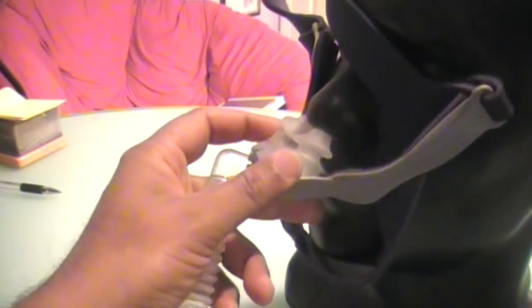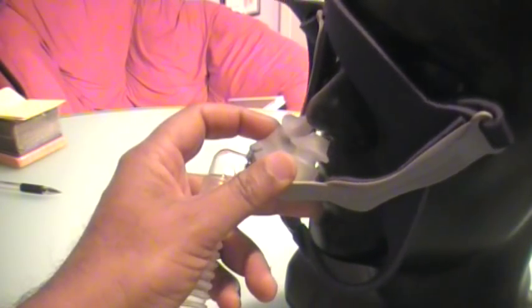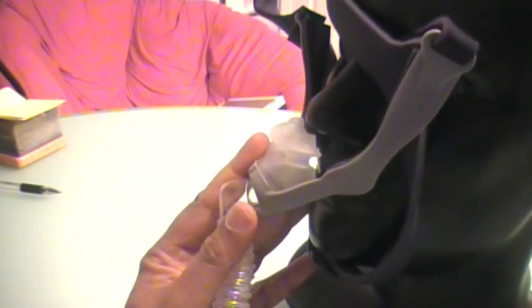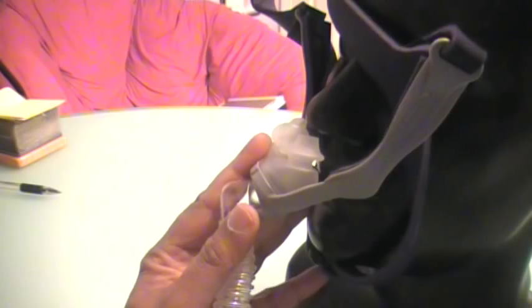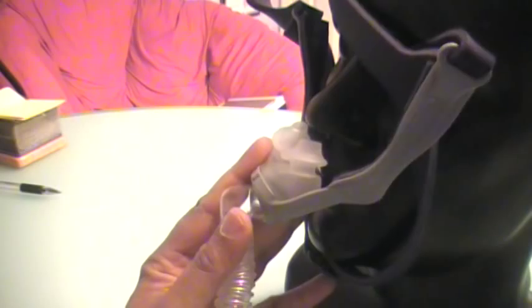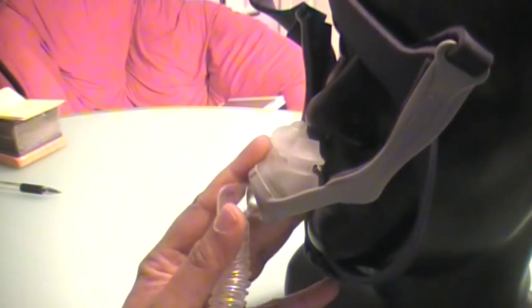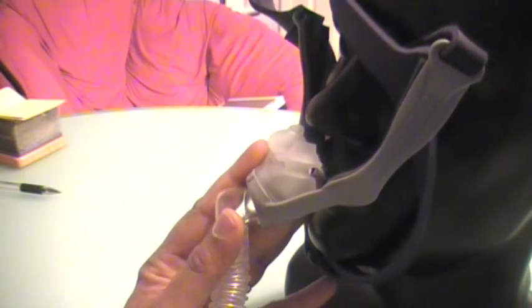This nasal pillow is extremely easy to clean. And if it ever pops out — see how it moves? It is so light that when you move around in bed and the pillows come off your nostrils, it's easy in your sleep to put it back into position. This is the Opus 360 Nasal Pillows made by Fisher & Paykel, and I wholeheartedly recommend it. It is my first recommendation for nasal pillows as of this date. Take care.